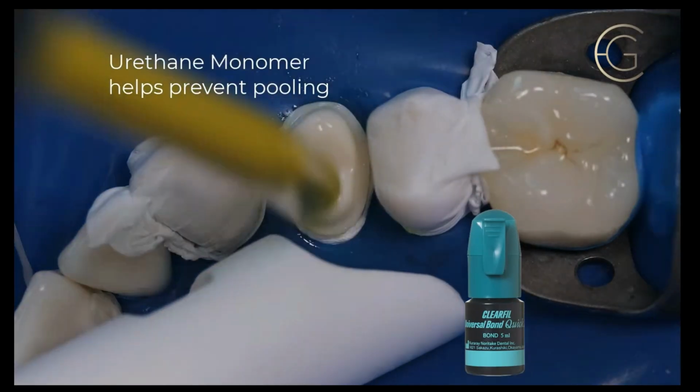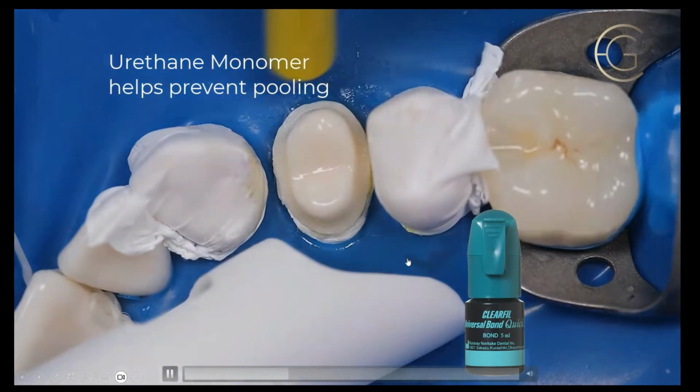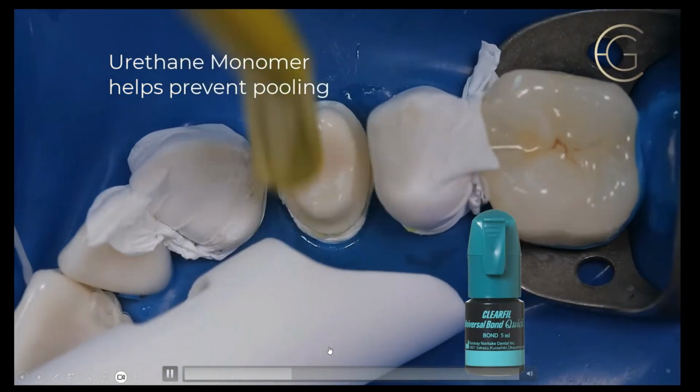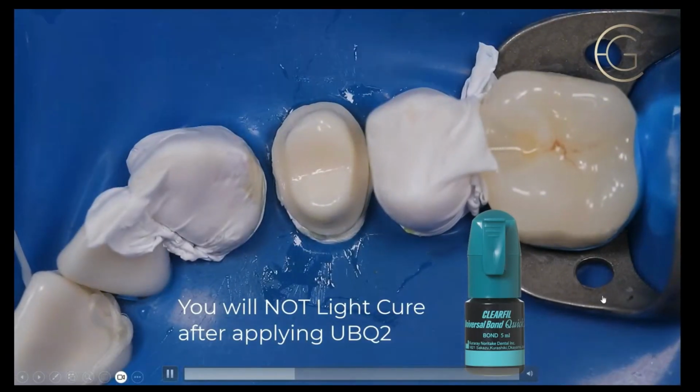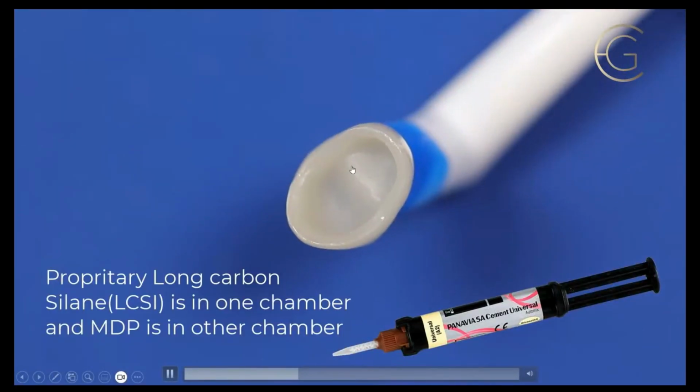In this case, with a veneer, you would not cure this, but with this you do. I love this urethane monomer that they have on this, and we're going to go forward here. So now we're going to load the restoration, whether this be the one adjacent to it over here that you see. I'm going to load it, and this has 2 tubes.